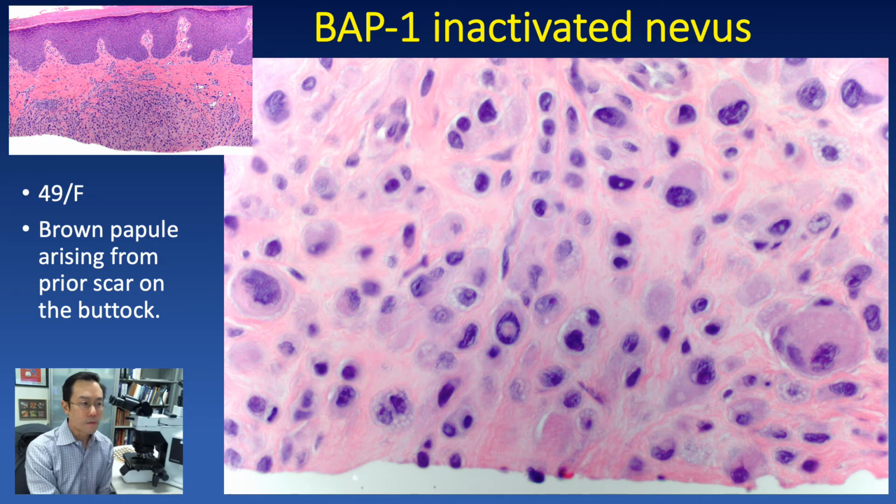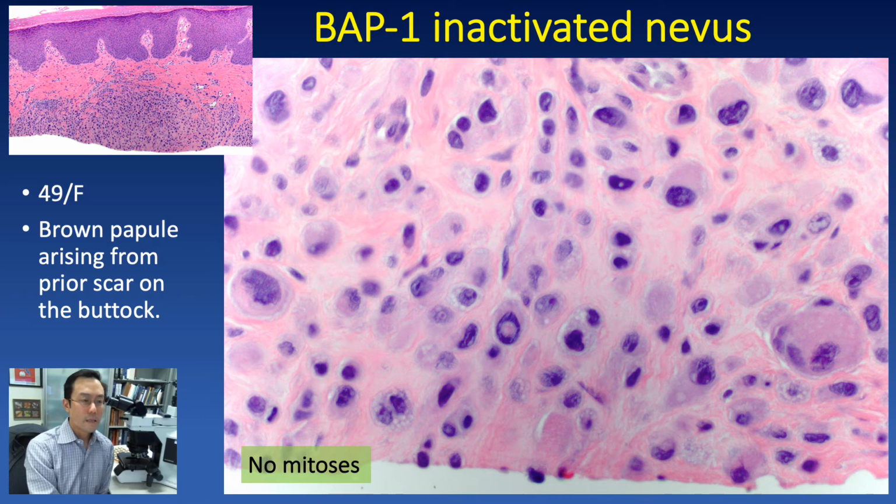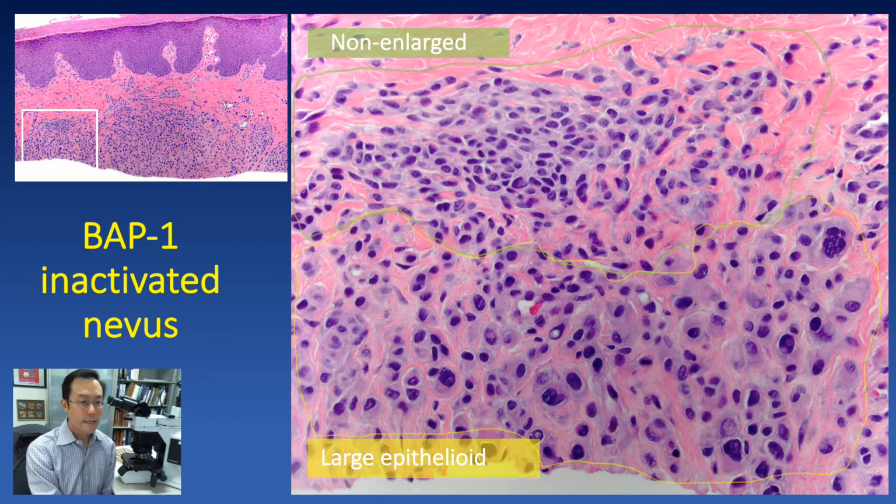Here's one example wherein we can see some markedly enlarged epithelioid melanocytes with large atypical hyperchromatic nuclei, yet no mitotic activity. These cells are amelanotic, but here's a relatively small and here a relatively large nuclear pseudoinclusion supporting melanocytic lineage. And taking a step back, we can see that superimposed on this atypical epithelioid melanocyte component, we have an associated benign or conventional cytologically bland nevus component adjacent.